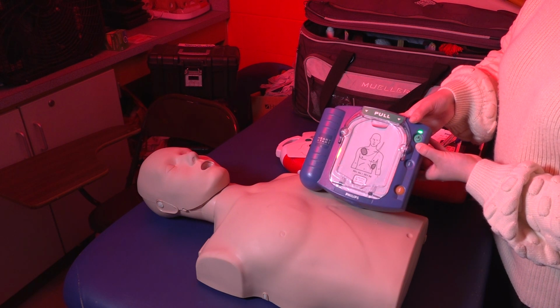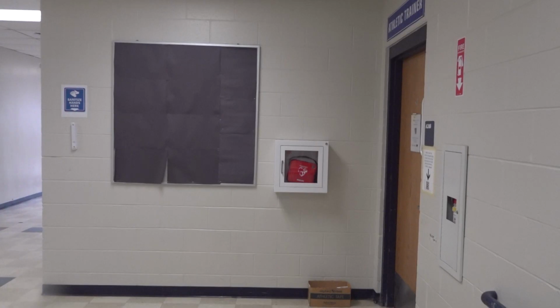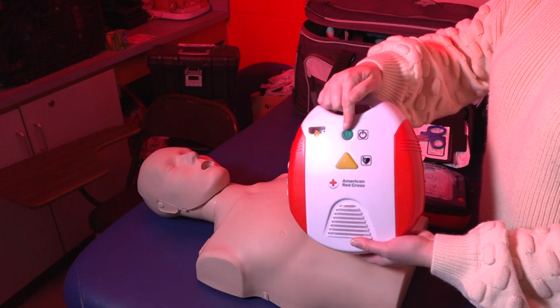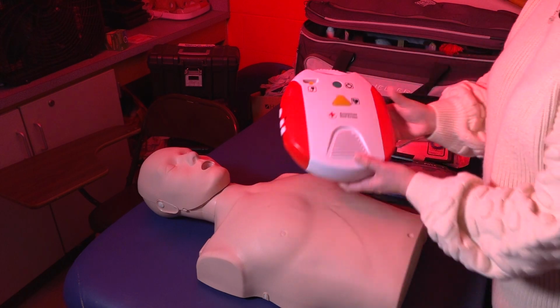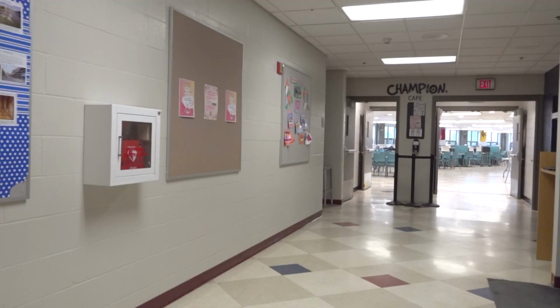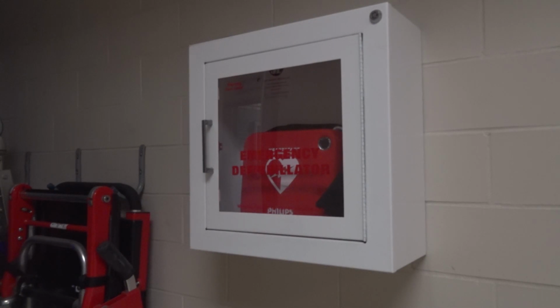Cut clothing if needed. With the frequent talk about NFL Damar Hamlin incident that occurred in the beginning of January, many people have become more aware of serious injuries that can impact athletes. With this story going around, we wanted to interview Walpole's athletic trainer, Amanda Randall, to learn more about AEDs located within the building and athletic areas at Walpole High School.